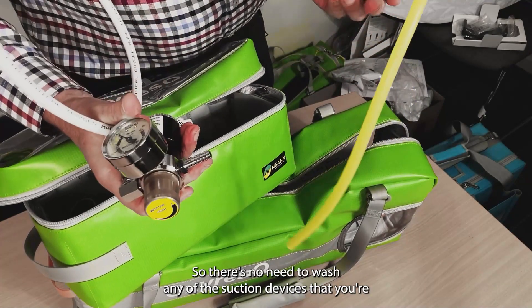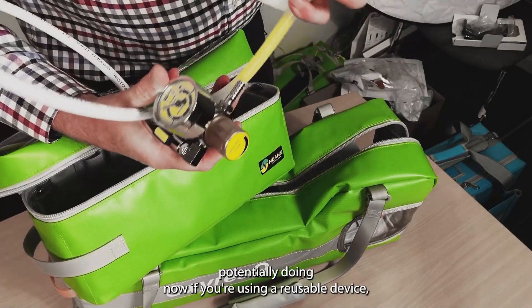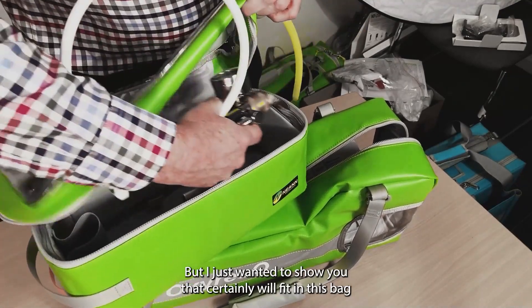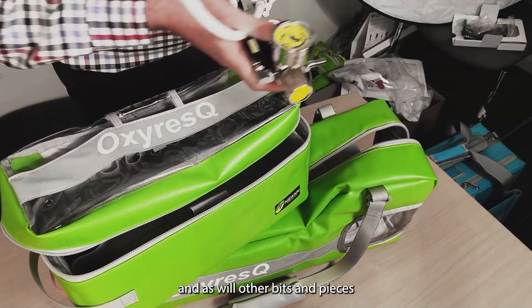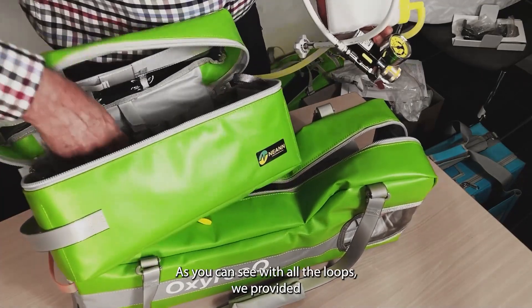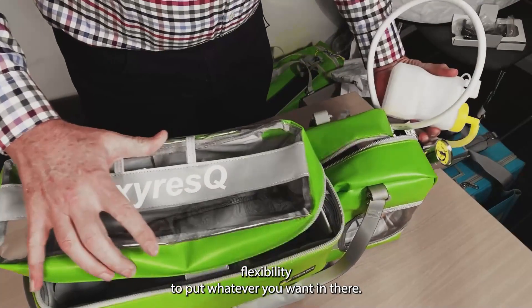There's no need to wash any of the suction devices as you potentially would with a reusable device — but that's a subject for a different discussion. I just wanted to show you that it fits in this bag, as will other items such as bag valve masks. As you can see with all the loops, we've provided flexibility to put whatever you want in there.